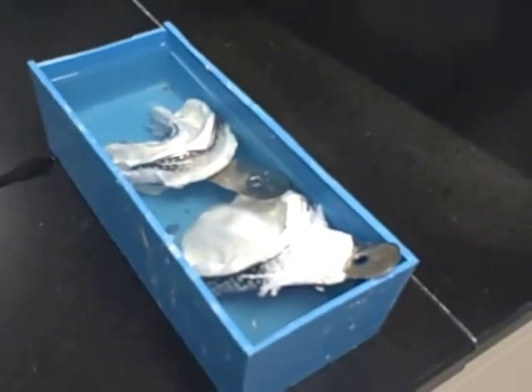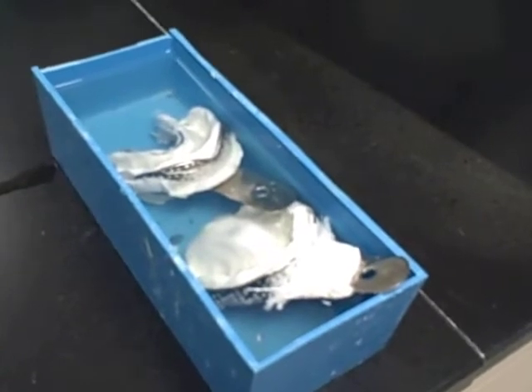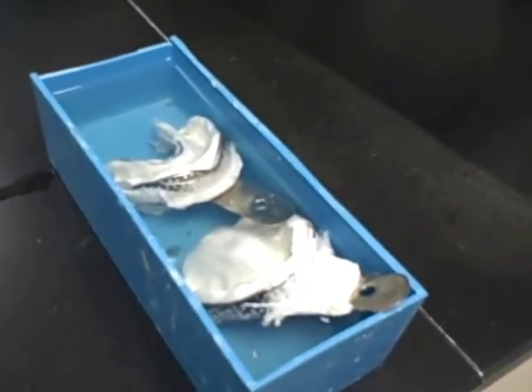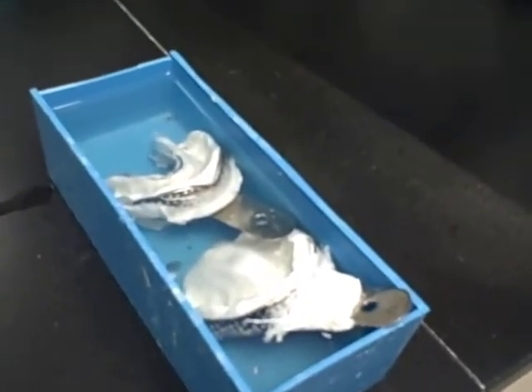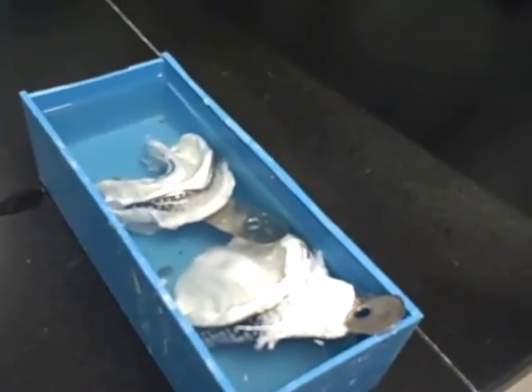Once we take the alginate impressions, we will come to the lab and we will put them in the bleach solution for ten minutes. They will soak in the bleach solution for ten minutes. Then we will be able to handle them in the laboratory situation. After they have been taken out of the bleach, we will rinse them off in water and we will continue to pour them up.